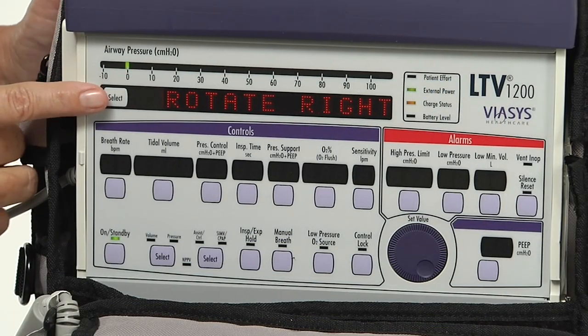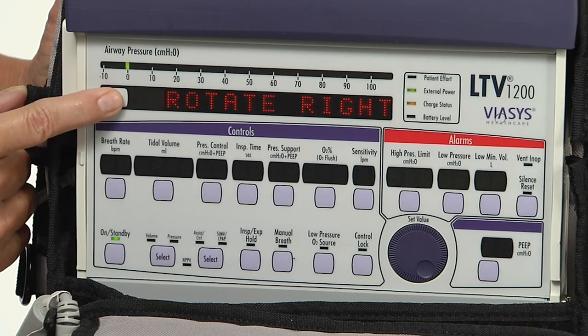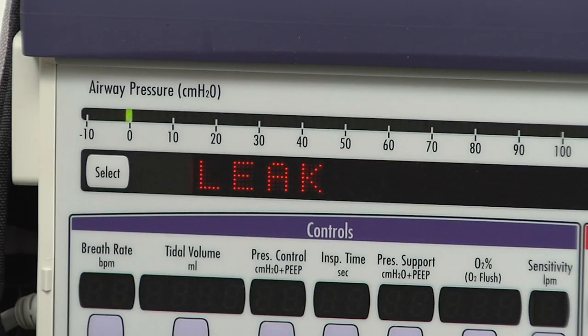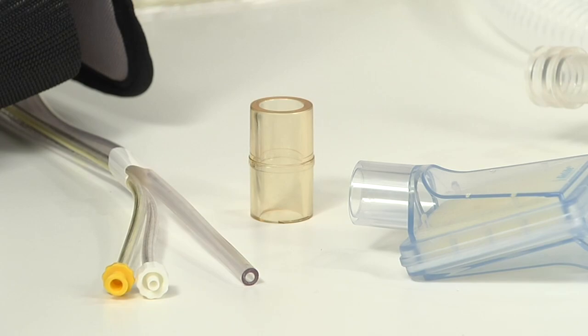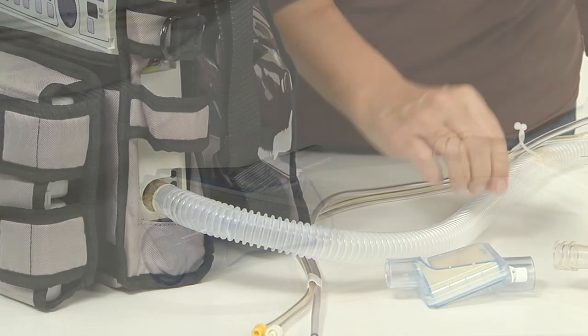To exit the control test, push the select button again and the next menu item is displayed. 'Leak' is now visible. Use the leak test to test the patient circuit for leaks. At this point the patient circuit is attached using the 22 millimeter adapter, and an HME filter is attached here if you choose to use it.